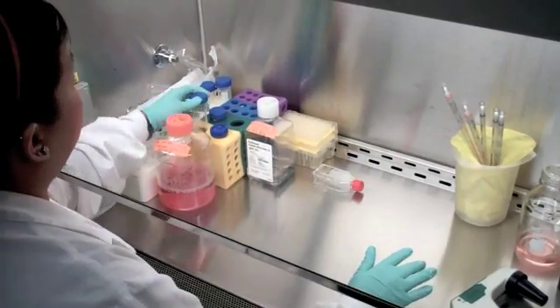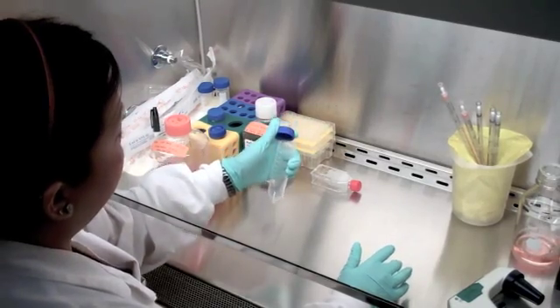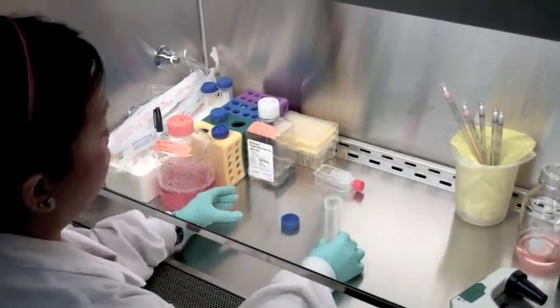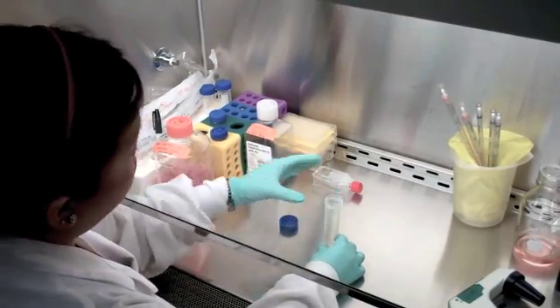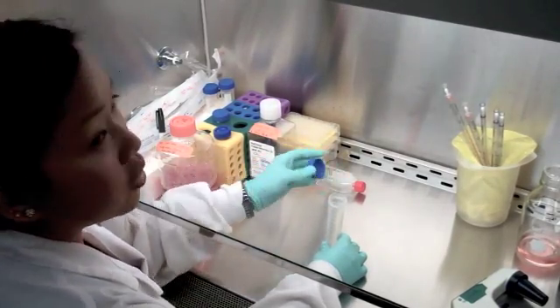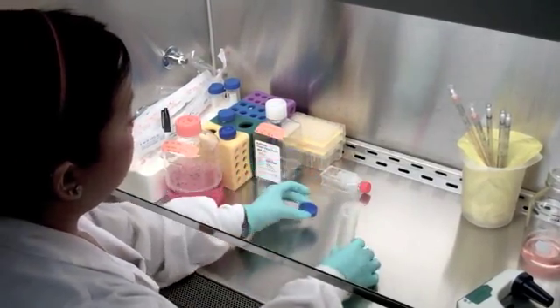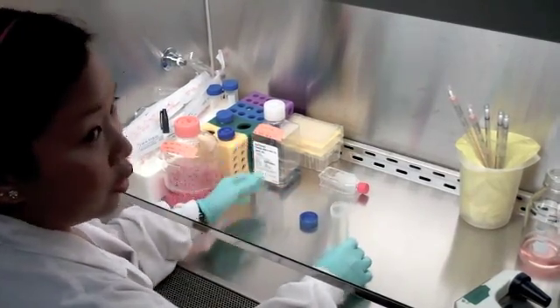Let's say I have my tube ready and I just happen to open it, or let's say they put the cap down, but they forget that the cap is right next to them and they want to grab the tube again — they go over. So your hand is already over the cap and whatever is inside, and when you close it, you will introduce contamination into the sample. Because there could be bacteria on your hand, skin cells are falling off, even though there's just a little gap.